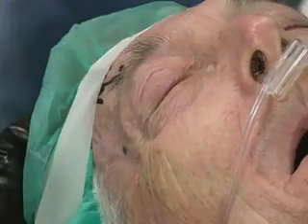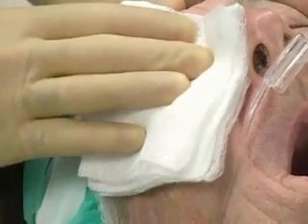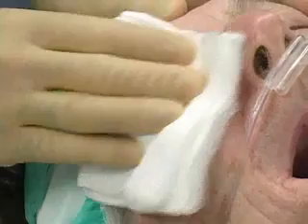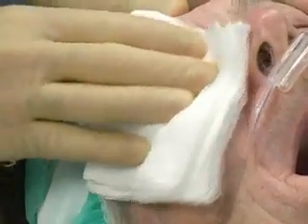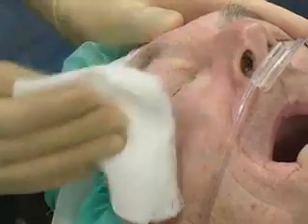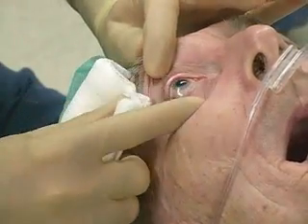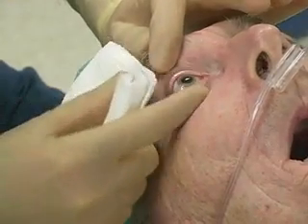Close the patient's eyelid and cover it with 2 pieces of 4x4 gauze. Gently massage the globe to achieve adequate spread of the local anesthesia. This increases both sensory anesthesia as well as ocular muscle akinesia. After massaging for 1 to 2 minutes, open the eyelid and examine the eye.